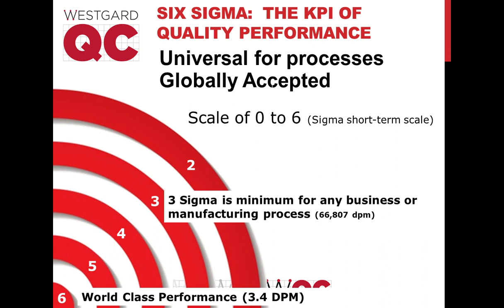You can take any rule that you want and turn it into a warning rule. Most of what our sigma metrics are doing for us is telling us what rules must be the rejection rules, and then any other rule beyond that, if you want to turn it into a warning rule, that's perfectly fine. And use your professional judgment. If you want to see that and be alerted to it, that's fine.